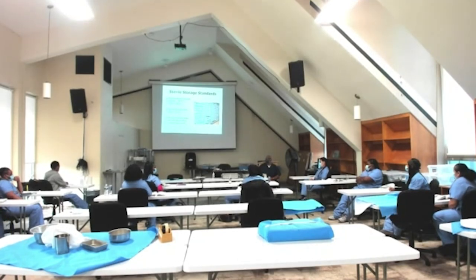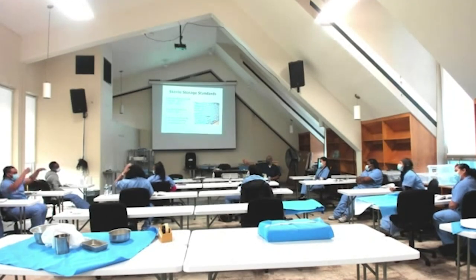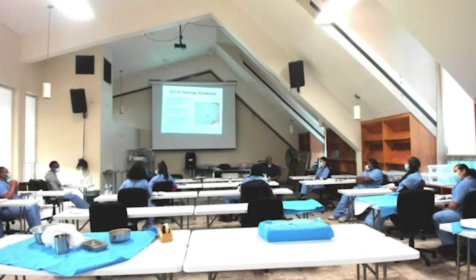You know what you need. What's the first thing you need when you walk in decon, Terrell? PPE. What is that? Which consists of? Come on, you're the one in there. What do you need?